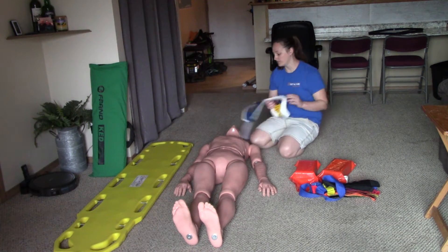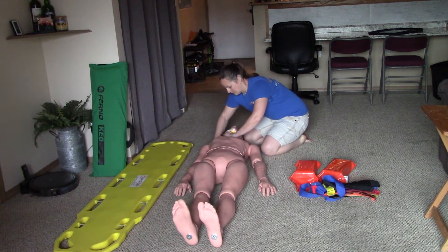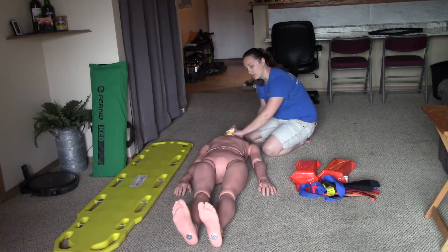My next step is to apply the C-collar. First I'm going to measure it. For bonus points, I'll verbalize that my partner is going to continue holding C-spine.